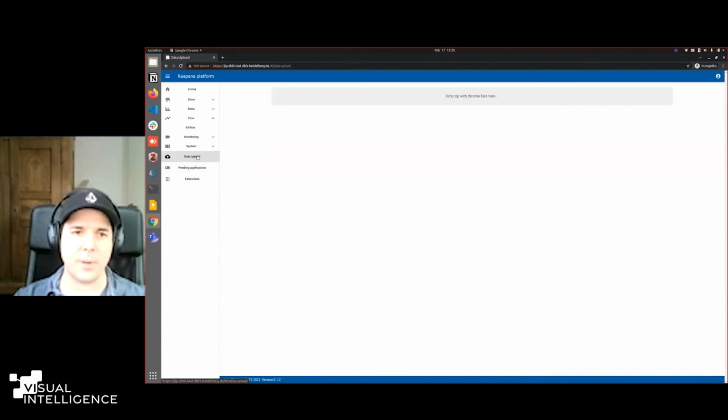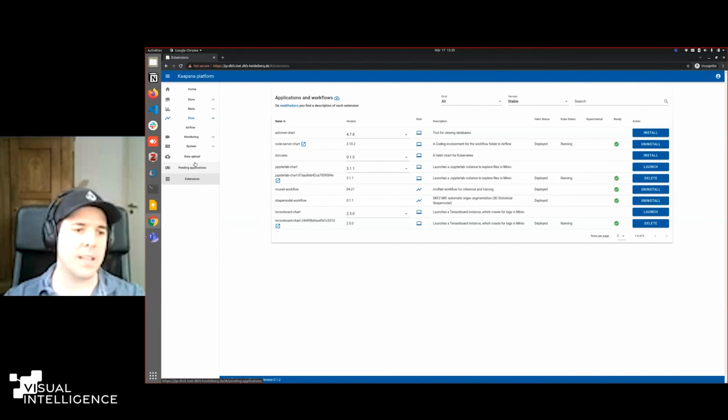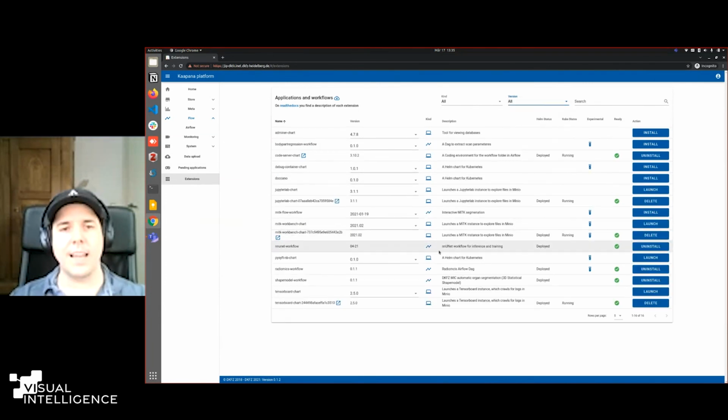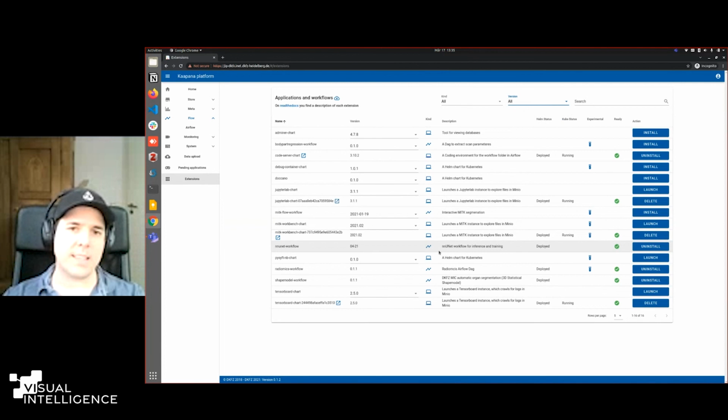So this is basically just about a browser-based data upload. Usually we are focused on DICOM send, so the data is sent directly from a PACS system or via a DICOM send command on any workstation. And the last big area I want to talk about is what we call extensions.